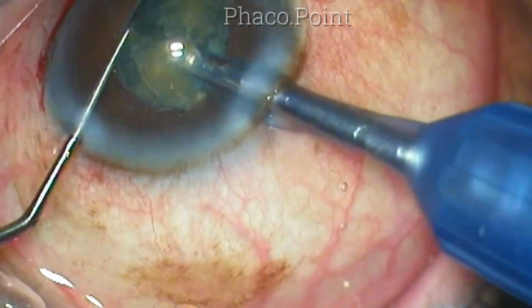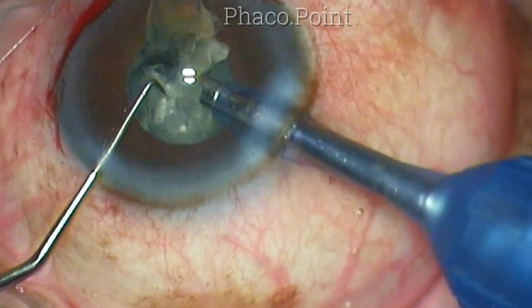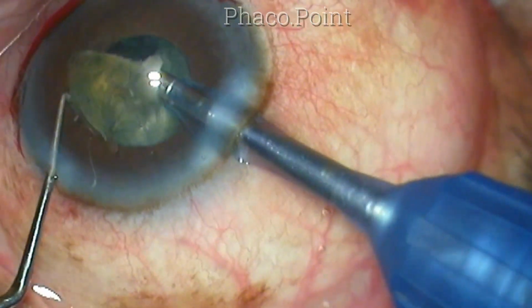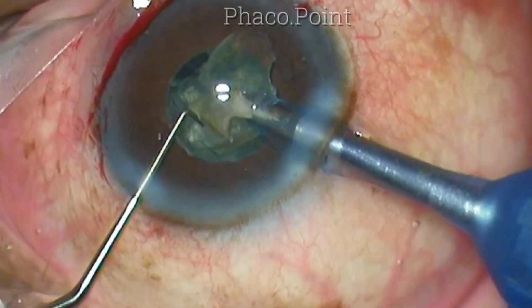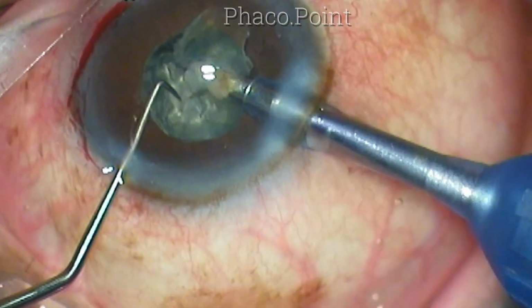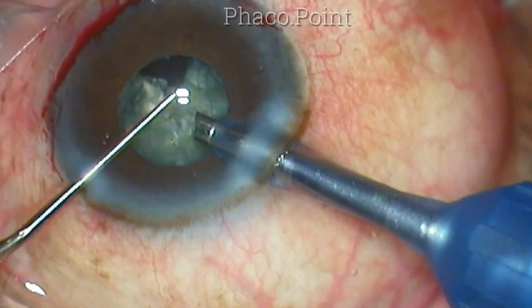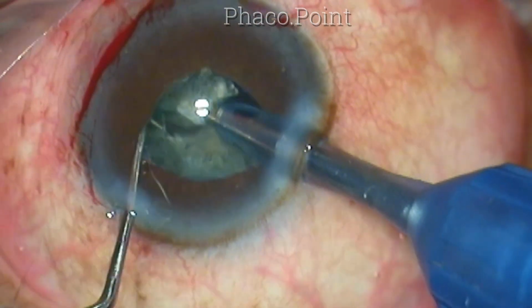Once the nucleus fragments are sufficiently small, then they are mobilized into the central zone and emulsified in the plane of the pupil. Gently swiveling the phaco needle will cause the aspiration flow rate to propel the pieces better towards the phaco tip, and I found that it improves the followability in my hands.